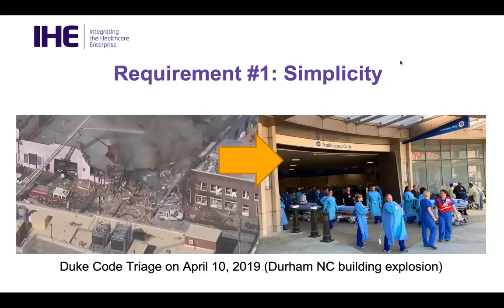You know they're a human being that needs help. You don't know that they may have an abnormal finding in the heart or the abdomen that you're going to take an ultrasound of, and you're going to need to snap pictures of those because they're going to be in the operating room a half an hour to an hour later getting that taken care of, and having that data referenceable in the medical record with some metadata becomes critically important in these settings.